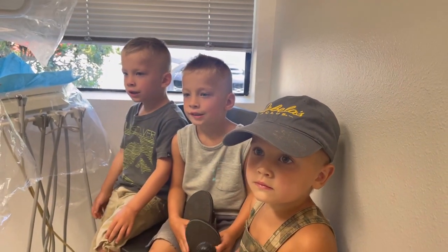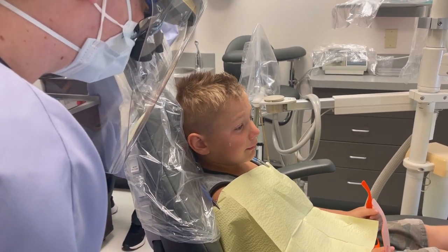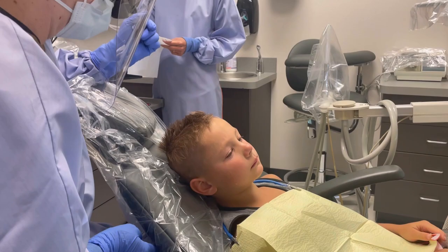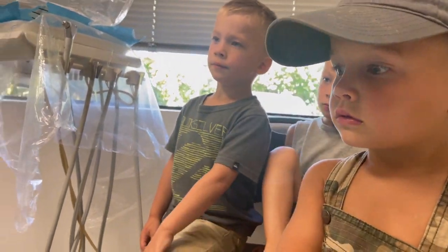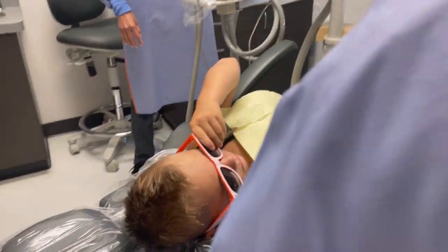Are you guys excited to watch Phillip? Yeah. Phillip, it's okay. Dr. Smith, I just want to take a look at your tooth — I heard it was really hurting you yesterday. I'm going to lay the chair back so I can take a really good look at that tooth, okay? I saw that we got a good picture of it, which is awesome. Go ahead and slide those sunglasses on for me. Wow, you look so cool, Phillip.